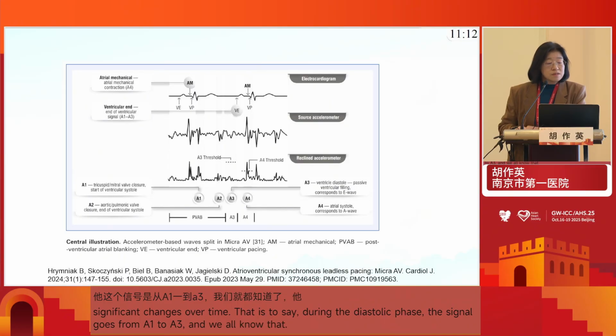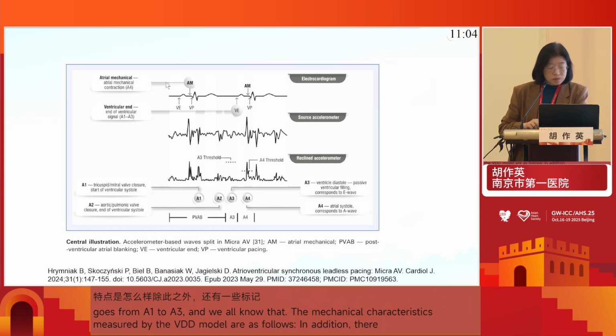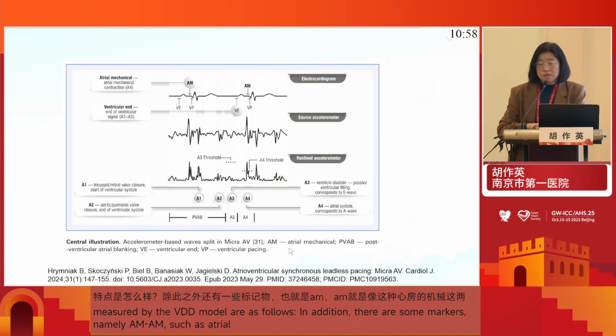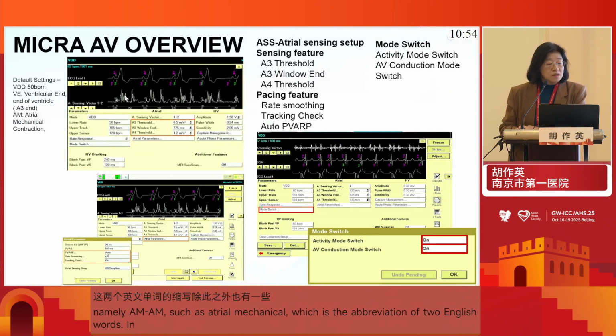And there's another marker, AM. AM means the atrial mechanical. And there is another marker I will say later. This is the programming of the Micra AV.